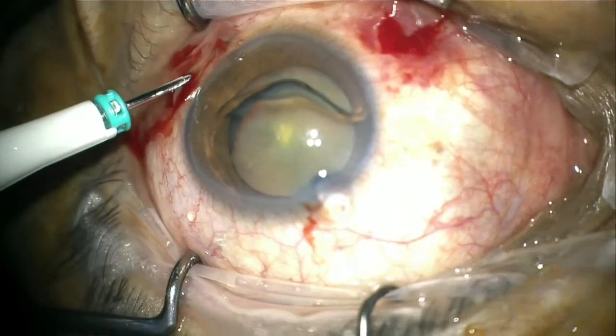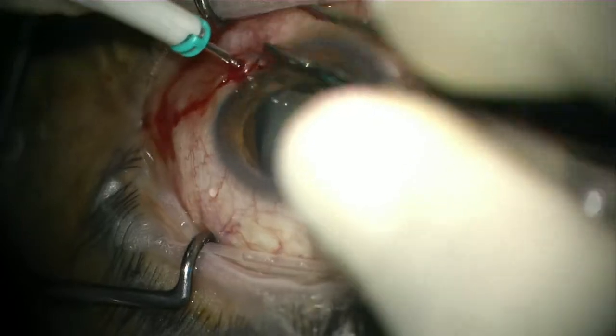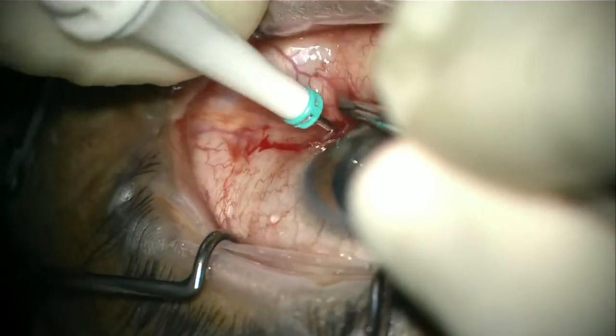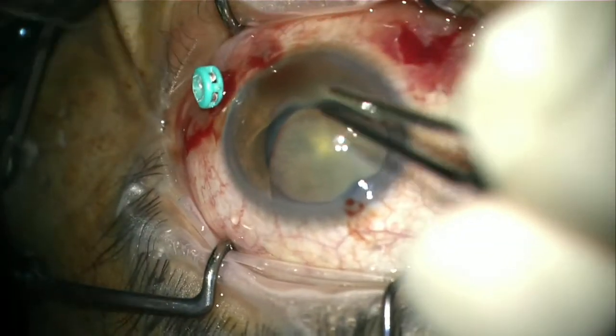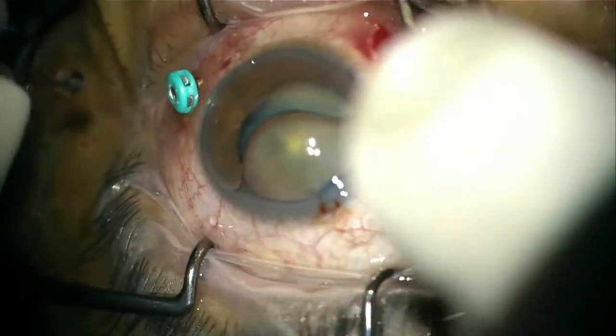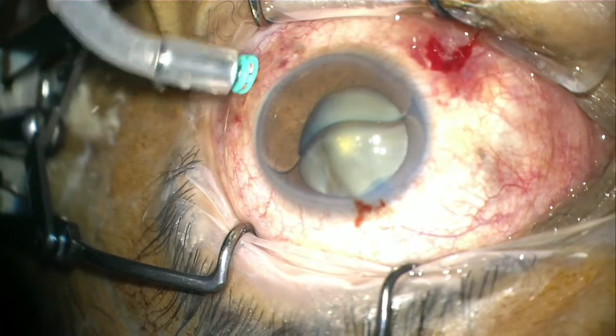The surgeon decided to insert a posterior infusion to push the oil backward and prevent more heavy oil from migrating to the anterior chamber. At the same time, this will make the phaco surgery safer. Viscoelastic was injected inside the anterior chamber to attain good pressure of the eyeball before the insertion of the trocar.